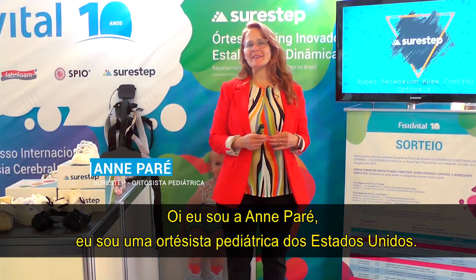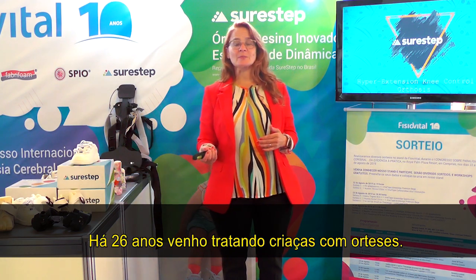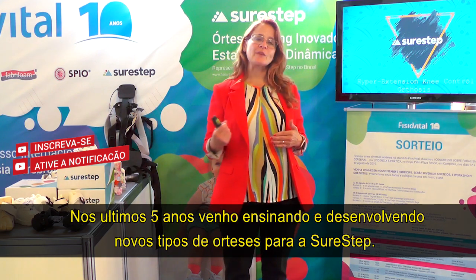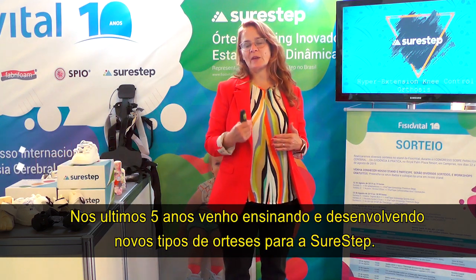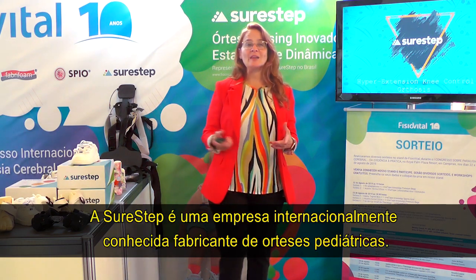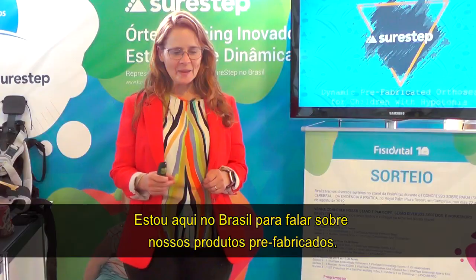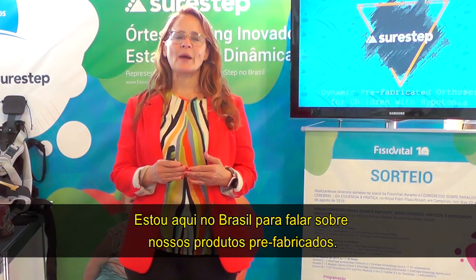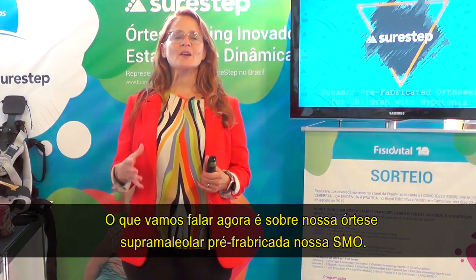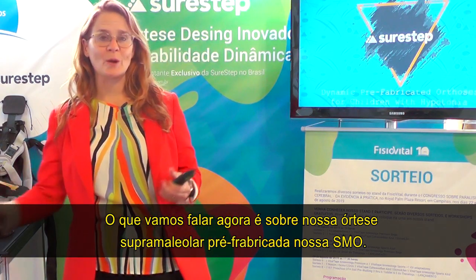Hi, I'm Ann Paré. I'm a pediatric orthotist from the United States. I've been treating kids with orthotic devices for 26 years now, and for the last five years I've been teaching and developing new types of braces for SureStep. SureStep is an internationally known pediatric manufacturer of devices. I'm here in Brazil talking about our new prefabricated devices — specifically our prefabricated supermalleolar orthosis, our SMO.